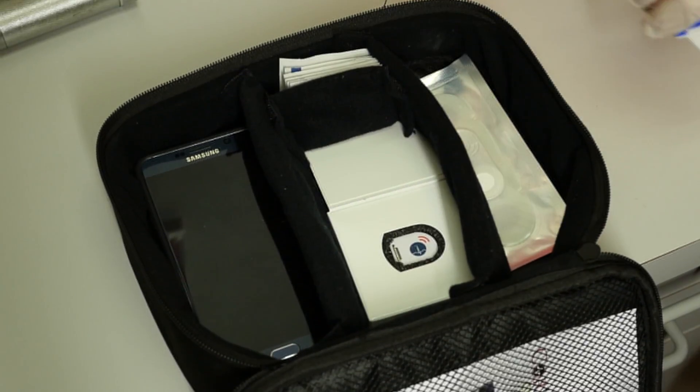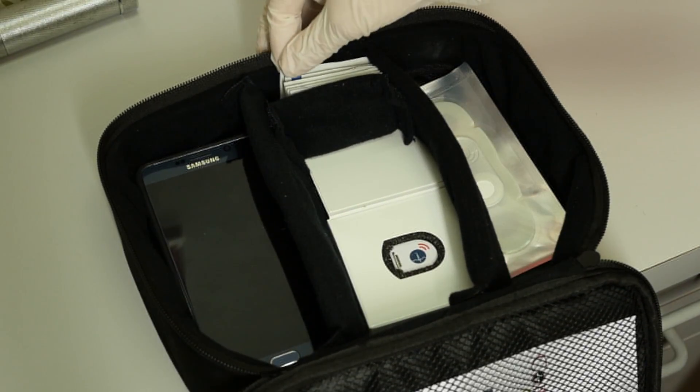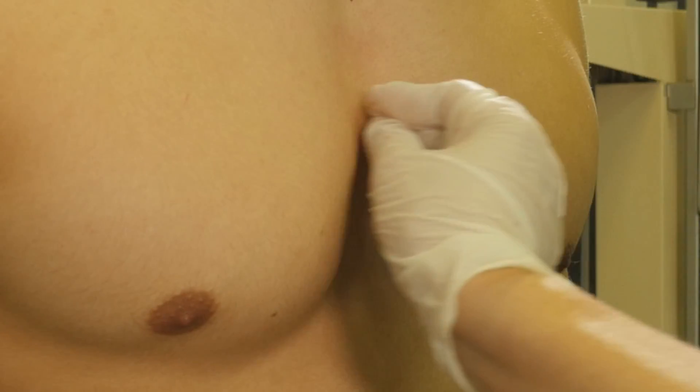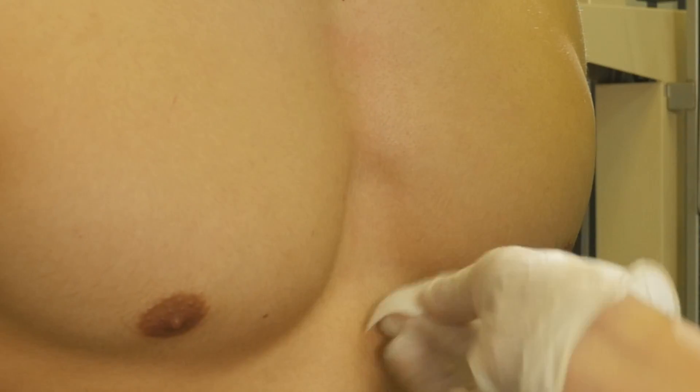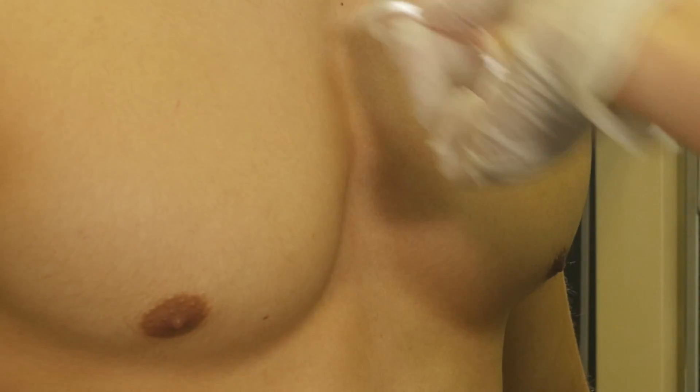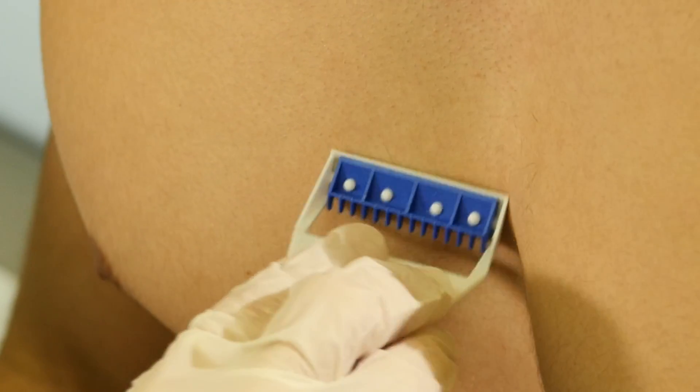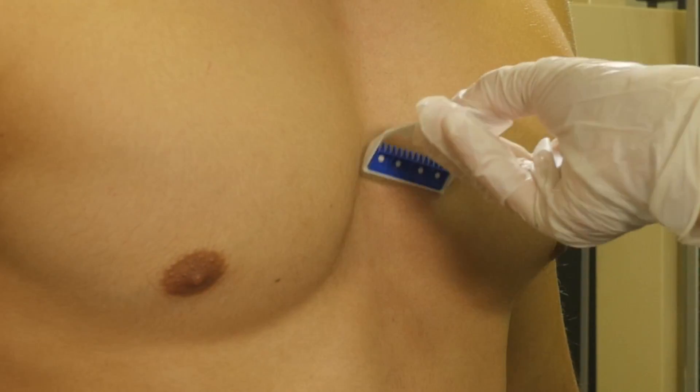Prepare the application area by shaving any chest hair with the disposable razors in the kit and use an alcohol swipe to clean and prep the skin. Be sure to remove any hair and debris.